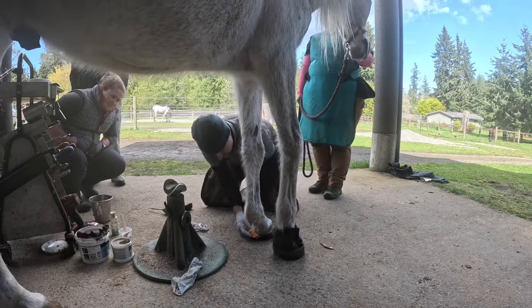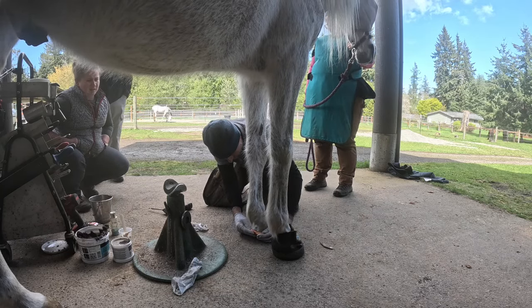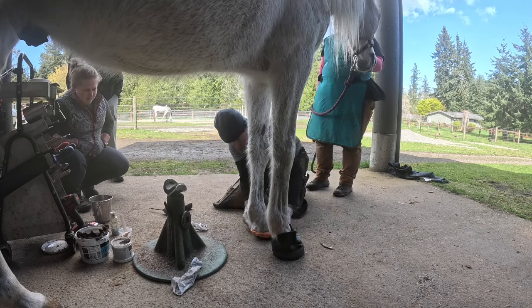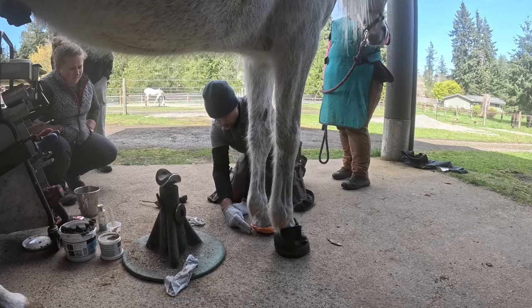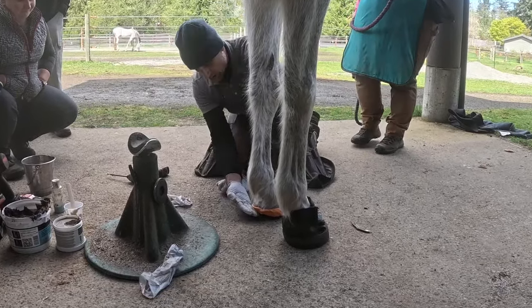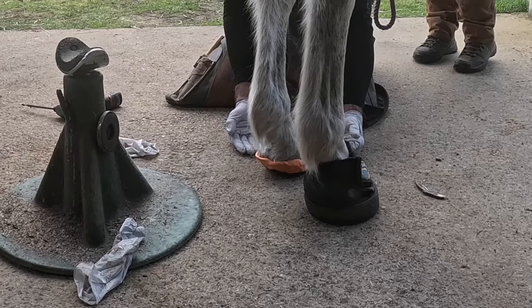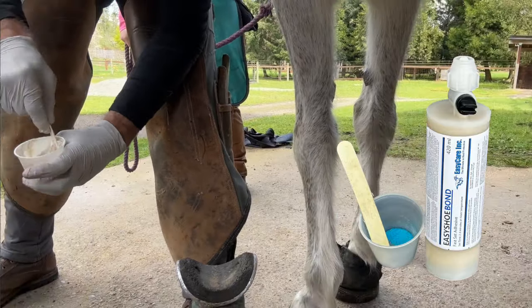Now I use this to create my dam where I don't pinch the heel. And I bring these wings around on both sides. And this is the real critical part about the casting: if the casting material is put up 90 degrees, within days of growing forward, it'll come into the coronary cushion and pinch it. But if you have it growing with the heel angle and the heel horn tubules, as it grows, it's an extension of the foot. I typically add a little copper sulfate to the acrylic glue while I'm mixing it up.